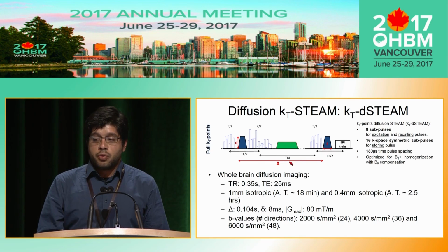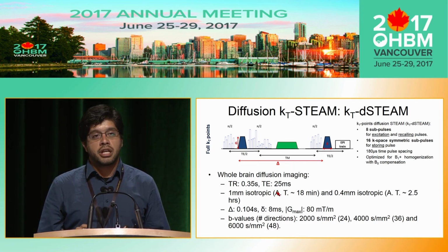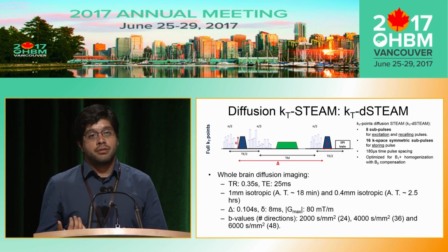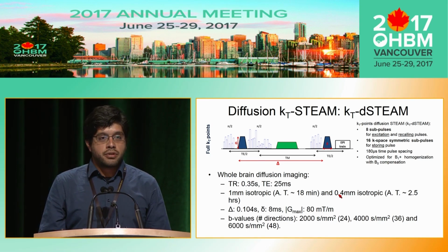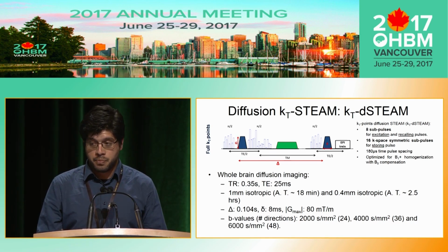Now we are going to use this sequence for acquiring 1 millimeter isotropic data that takes approximately 18 minutes for the entire brain. And we are pushing the resolution as much as the scanner can offer us, to 400 microns, which already takes 2.5 hours per volume.